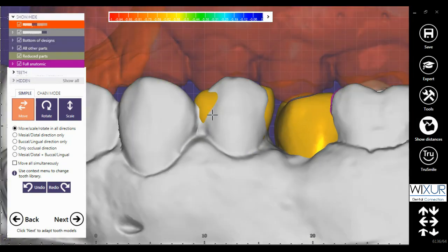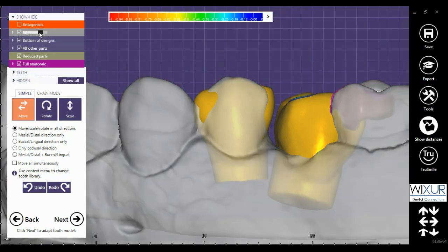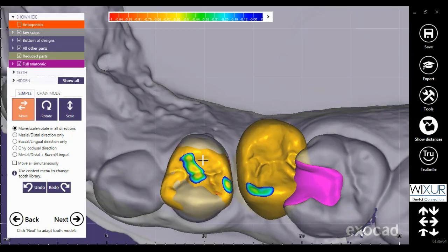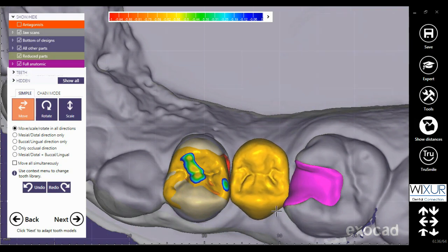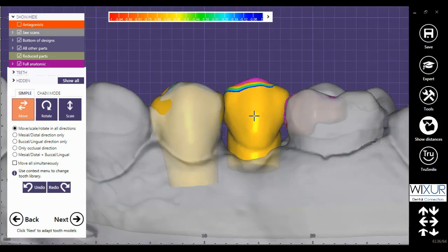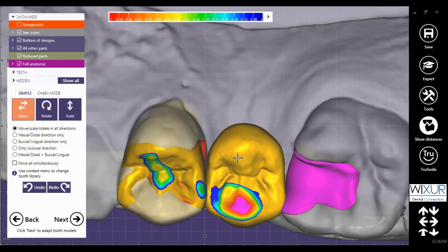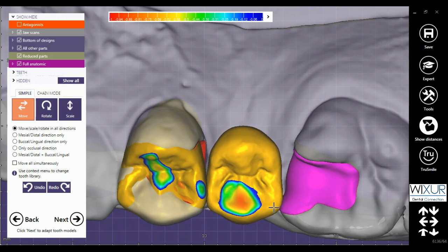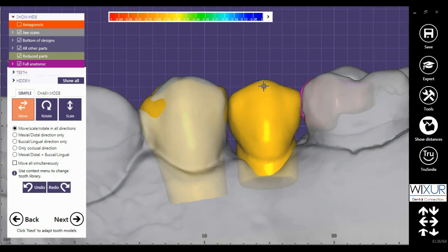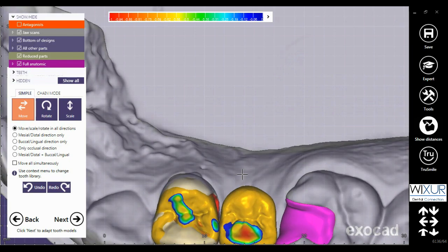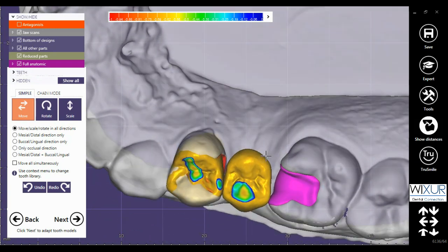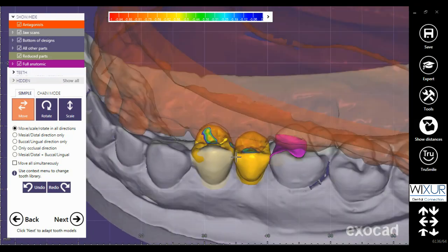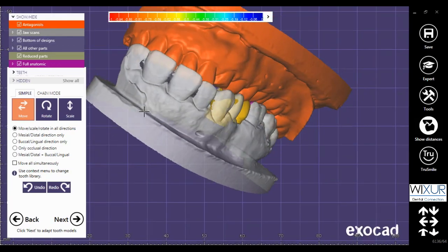Keep watching until I finish the design in this part. I am using hotkeys to complete the design, such as holding the alt key on the keyboard to bring the antagonist. Using the wheel at two points to finish with the pre-molars.